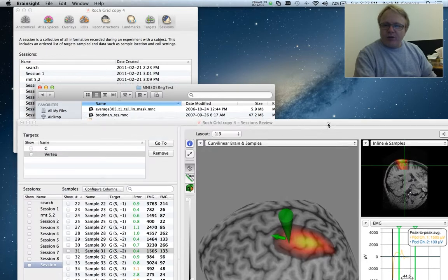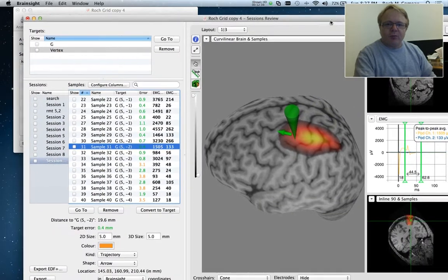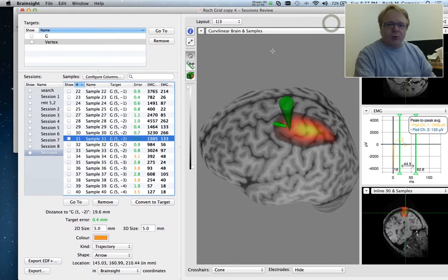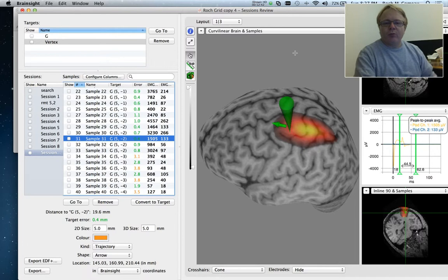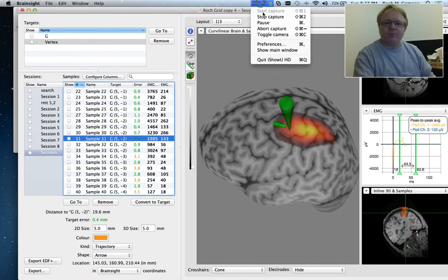And that's essentially it. So this is our tool to review a BrainSight session. Thank you.